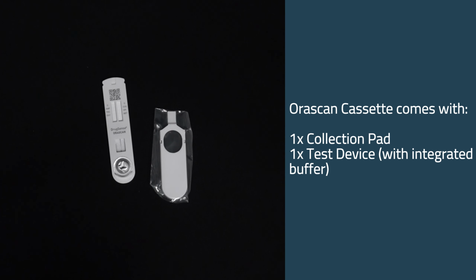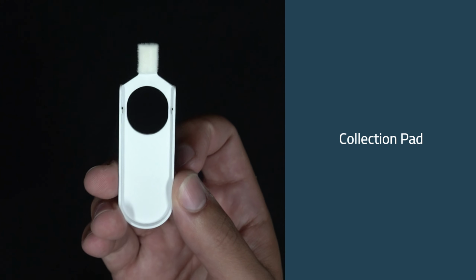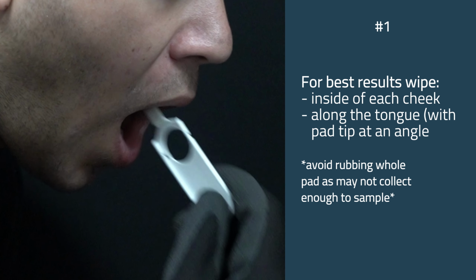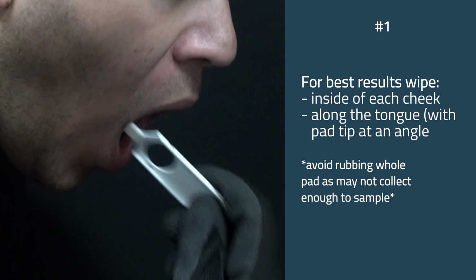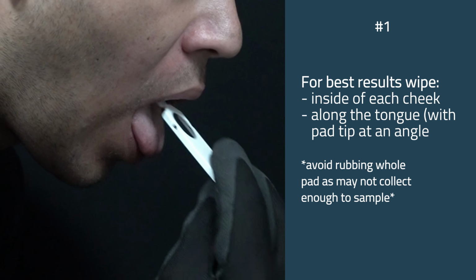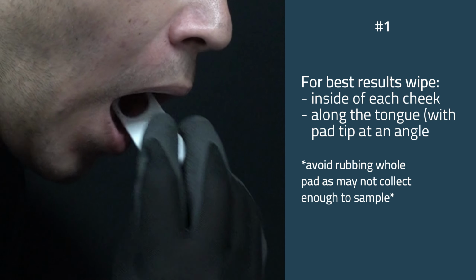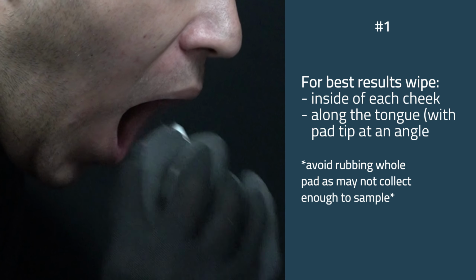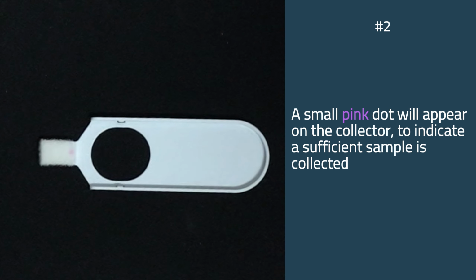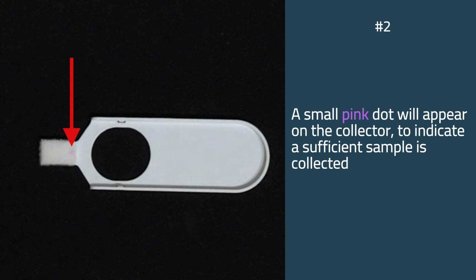The OraScan cassette comes with 1 collection pad and 1 test device with an integrated buffer. For best results, wipe inside of each cheek as well as along the tongue with the pad tip at an angle. Avoid rubbing the whole pad as it may not collect enough sample. A small pink dot will appear on the collector to indicate a sufficient sample is collected.